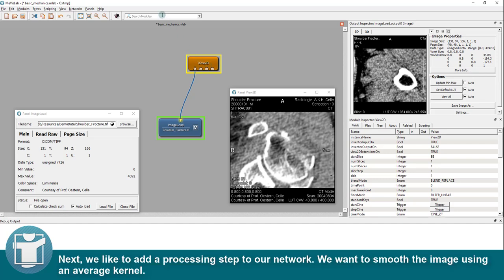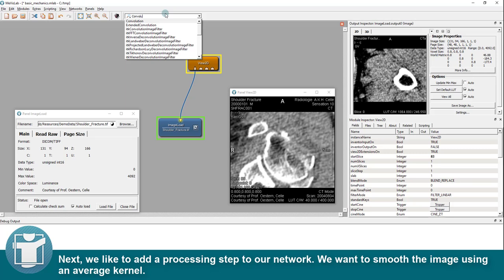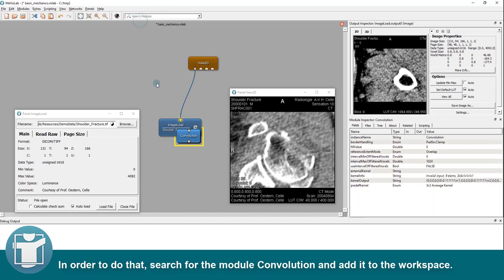Next, we like to add a processing step to our network. We want to smooth the image using an average kernel. In order to do that, search for the module convolution and add it to the workspace.